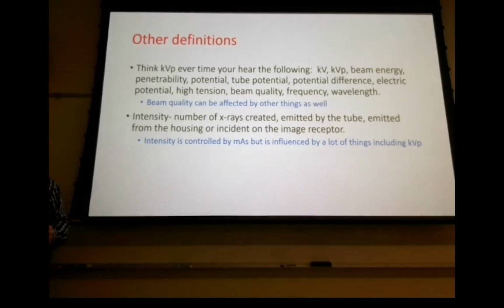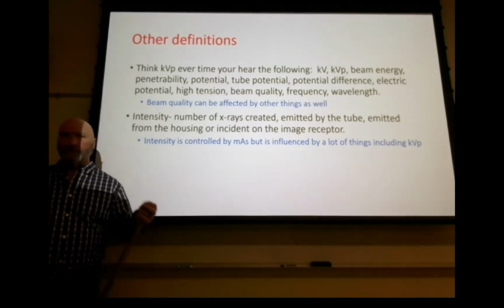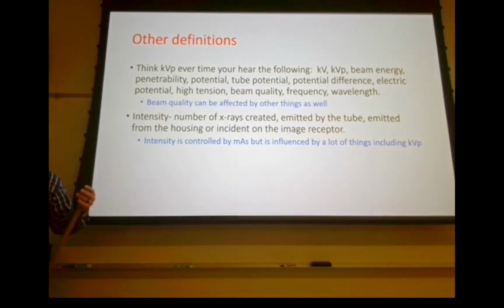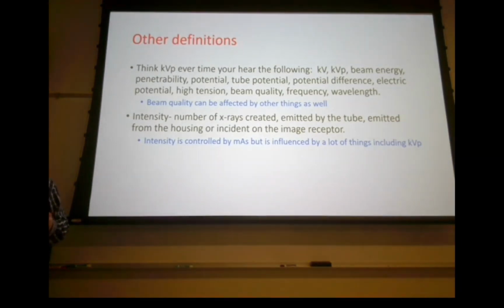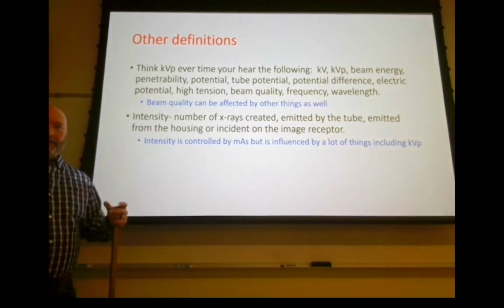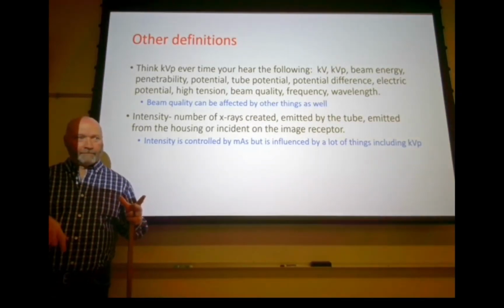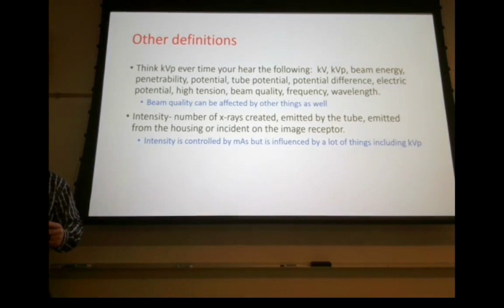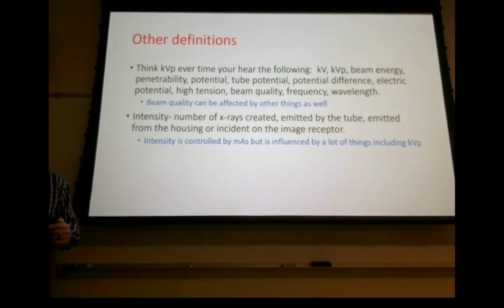A patient has to have something that's radio opaque and something that's relatively radiolucent, right? So take something, and you can bring something from home. If your dog has a bone, stick it in your backpack and bring it. A real bone, not a milk bone. Take that, get you a basin of water, put it in the basin of water. Now you've got a femur, essentially, right? Because you've got a fluid-filled structure with a bone inside of it. And make x-rays of that. Use low kVp, use high kVp, change your focal spot size, change your distances, change your OID, change your SID.